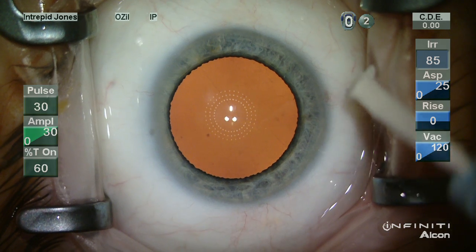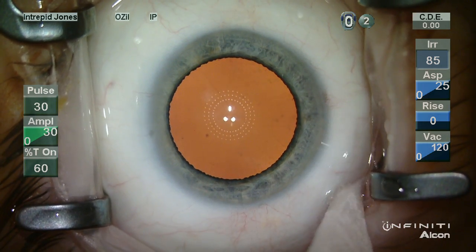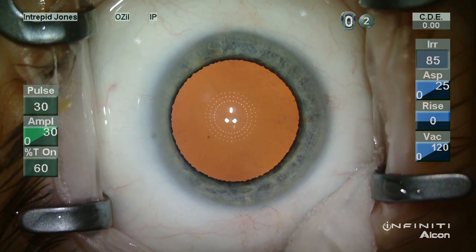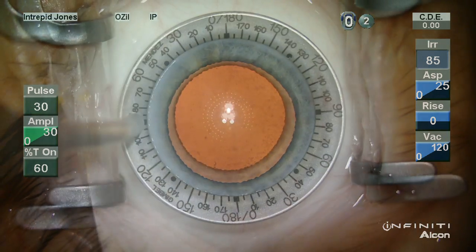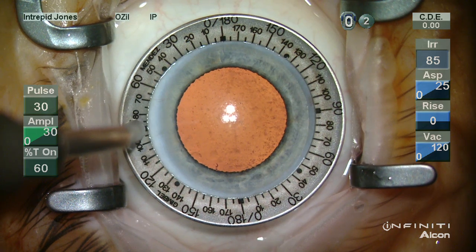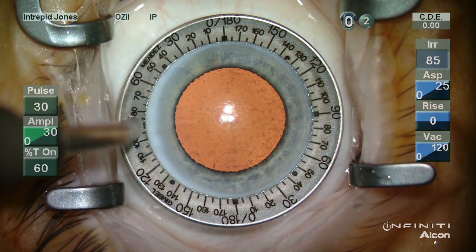Once again we reveal the marks made by reference at the slit lamp and we dry the fornices. This is very important — you want to make sure you have a dry fornix, as the ring will imbibe fluid and then obscure your marks at the limbus as well as the marks that you create.